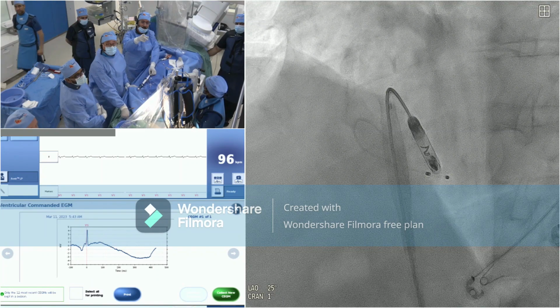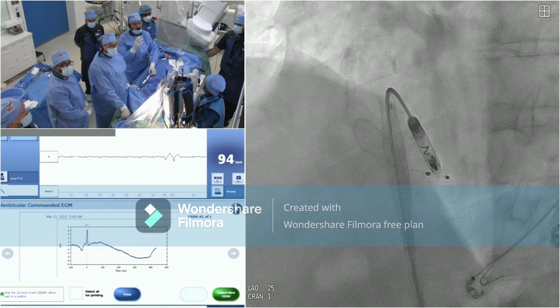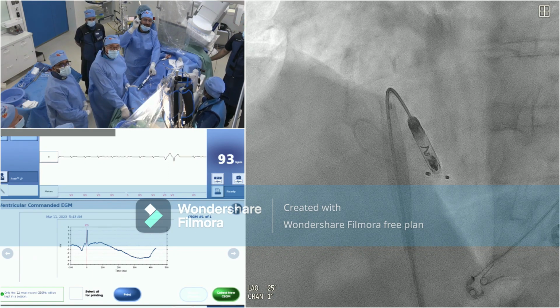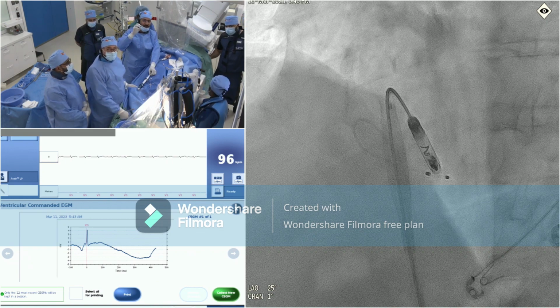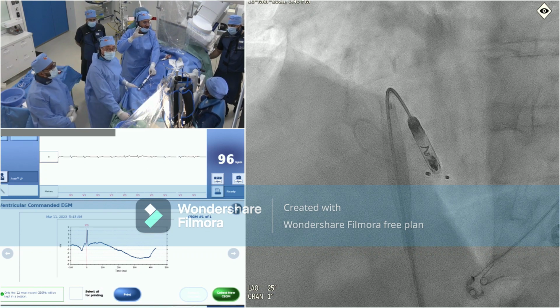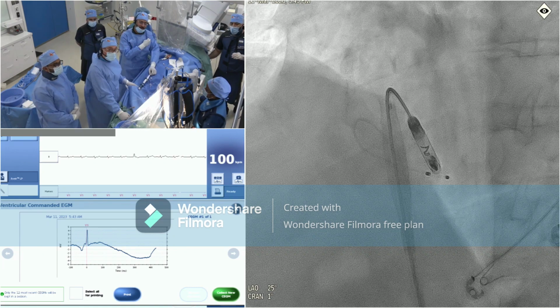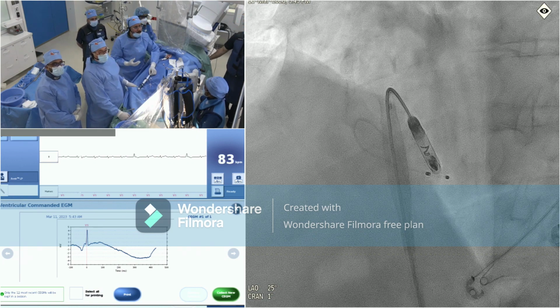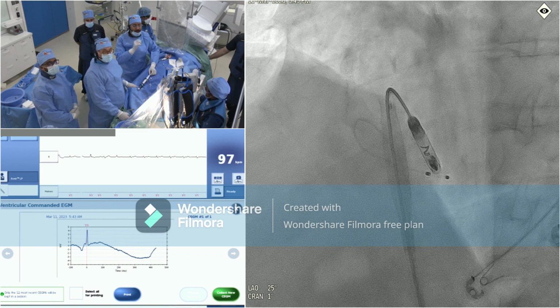So now you can see the programmer, and actually this system is not real time as you are used to with a regular device. It takes snapshots, and it will tell you the current of injury, the impedance, and the threshold. So this is very important. It's like taking camera snapshots. Even the programmer is not the regular programmer. This is a unique programmer link system that we use with special electrodes with a special positioning on the chest. So this is a very important point to keep in mind. It will not work with your regular programmer. You need to have another programmer.